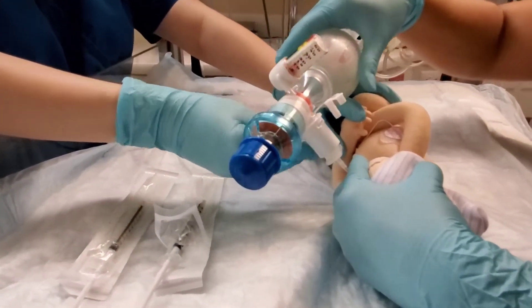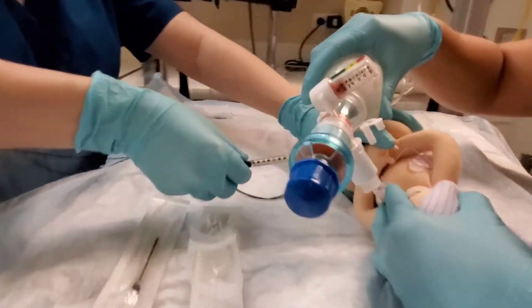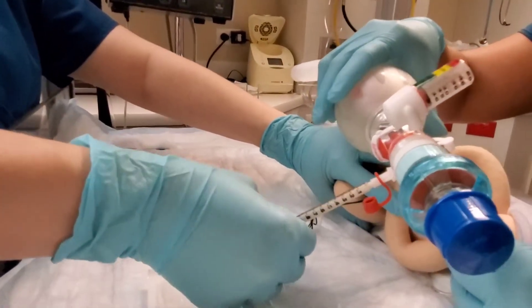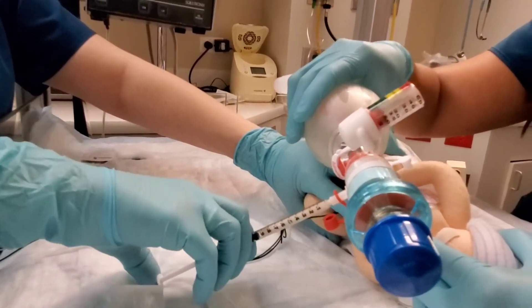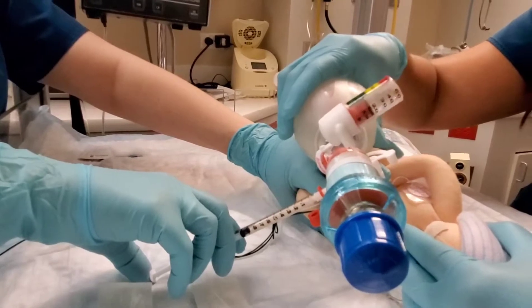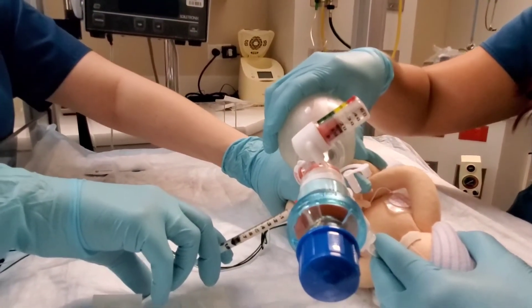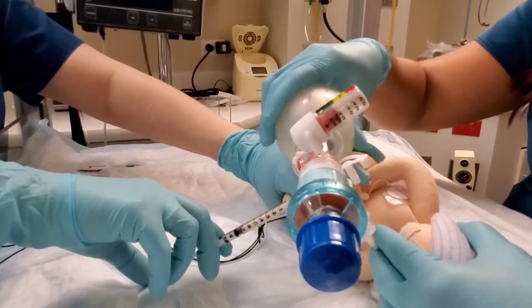So what we're going to do is we've separated these into two different aliquots, and it makes it a lot easier for the person administering it to know exactly how much to give. In this case, the baby weighs 600 grams, so we've separated into two aliquots — 0.9 and 0.9. As you can see, it's being administered very slowly.